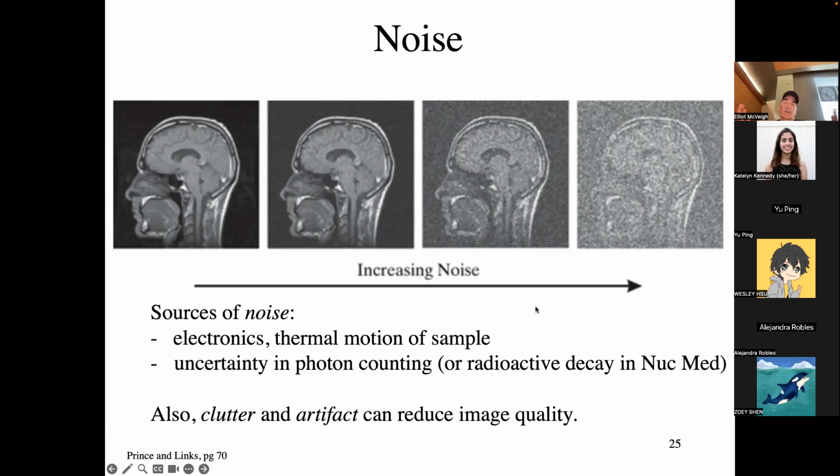So where does this noise come from? In MR, the noise is usually mostly from the patient, okay? So you have electronic systems in an MR where you're measuring radio frequency coming out of the patient with an antenna. And inside that antenna will be preamplifiers and things like that, and tuning circuits and whatnot.